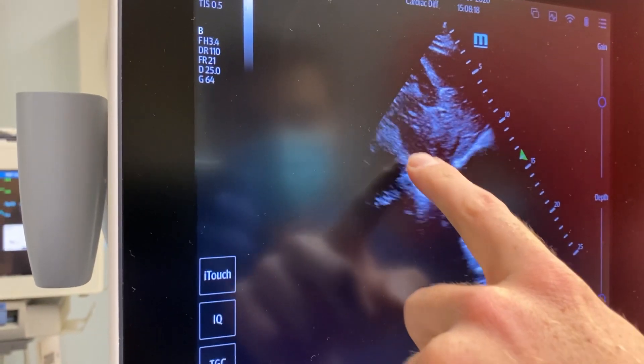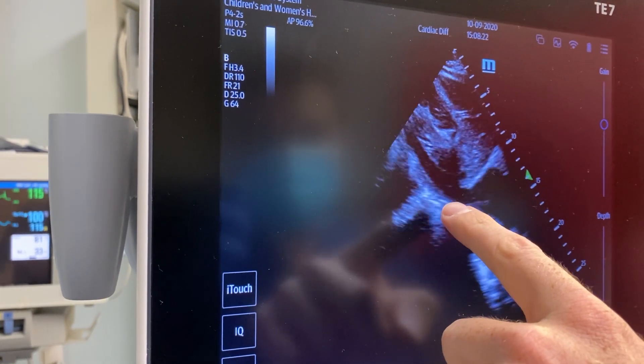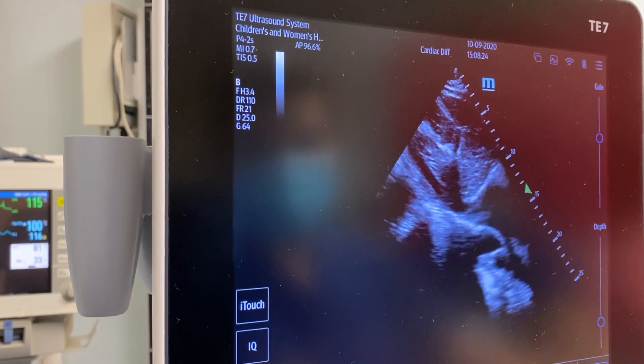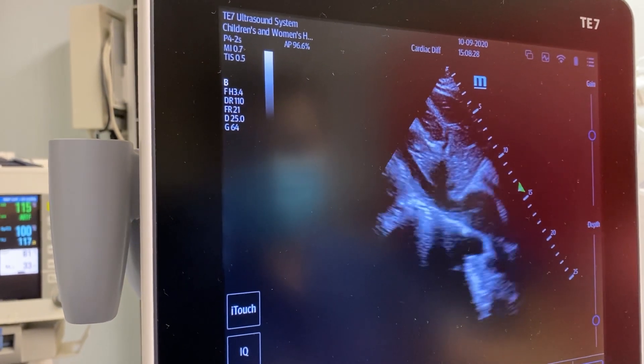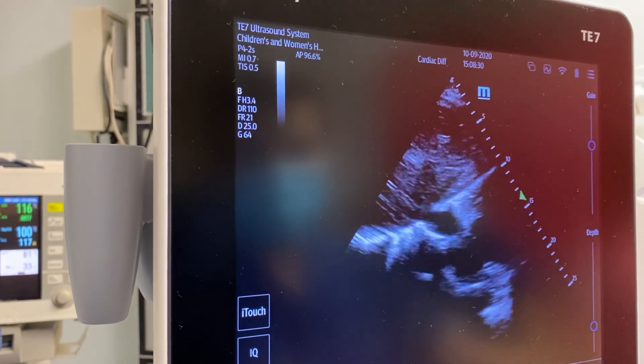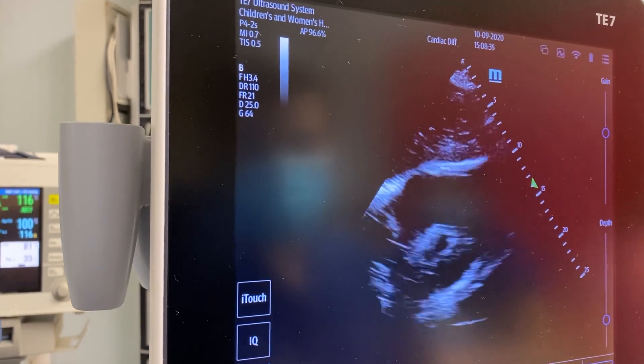There's a right atrium right there, and there's my IVC, and it's collapsing a little bit. So we can give him some more fluid — or at least he can take more fluid. We'll go ahead and give him another liter, and his heart squeeze and everything looked pretty normal.